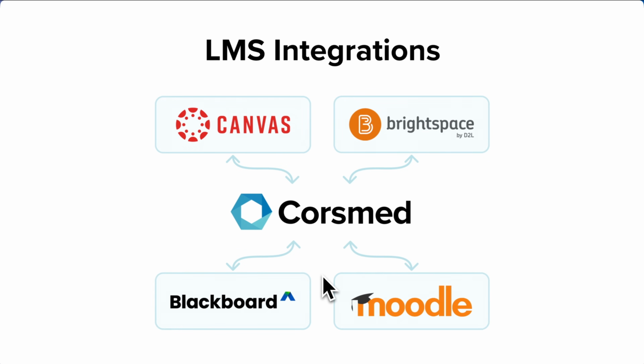Last, Corsmed can also be integrated with other teaching platforms. If you currently use a major LMS system, such as Canvas, Brightspace, Blackboard, or Moodle, we can integrate Corsmed directly with these platforms, and we can even make custom integrations as well.